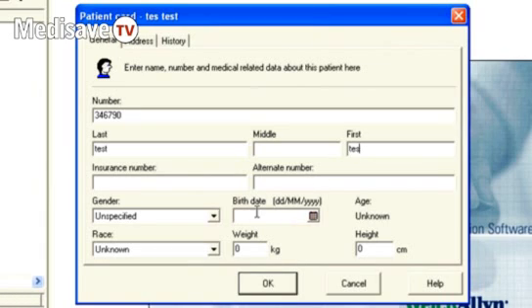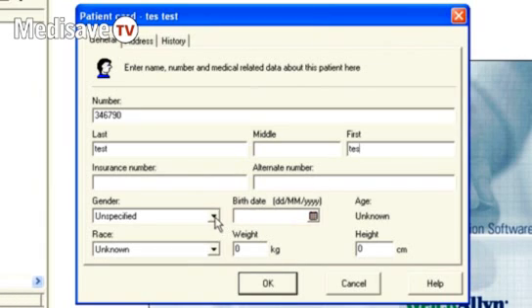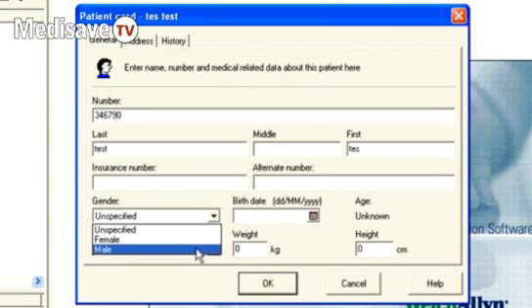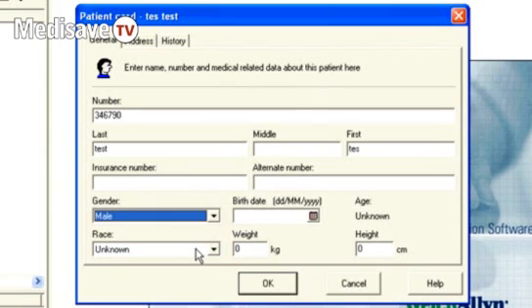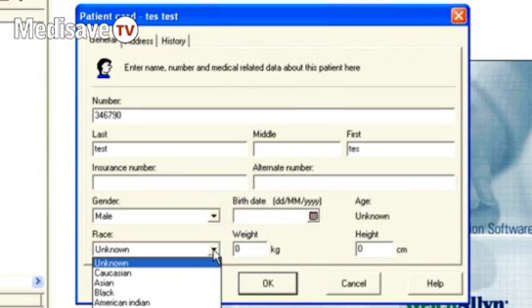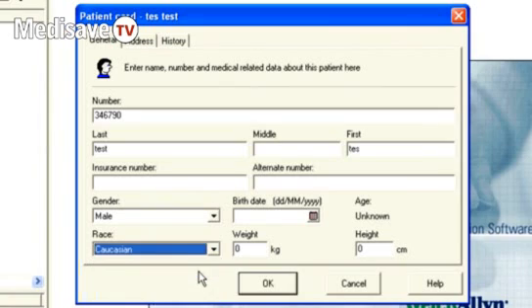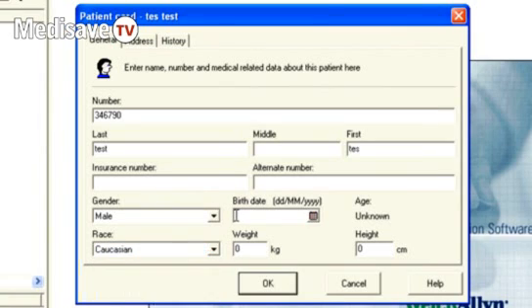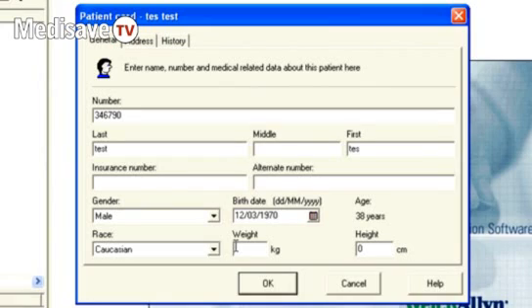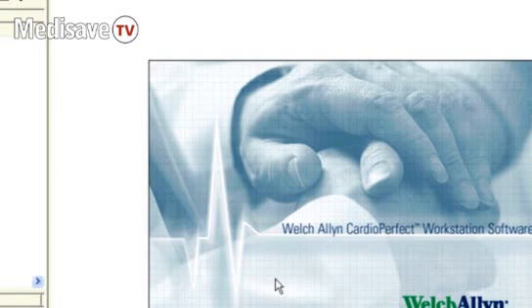This will include their gender, their race, their birth date, their weight in kilograms, and their height in centimeters. The software uses that information to work out their predicted results.